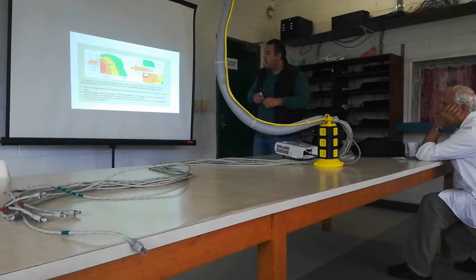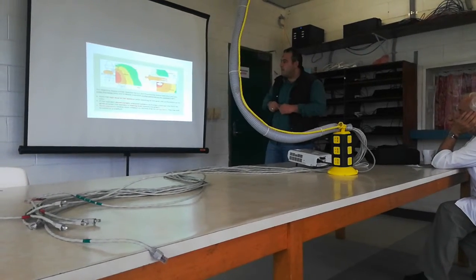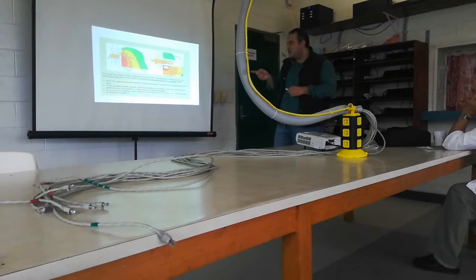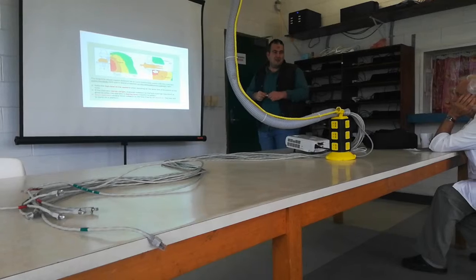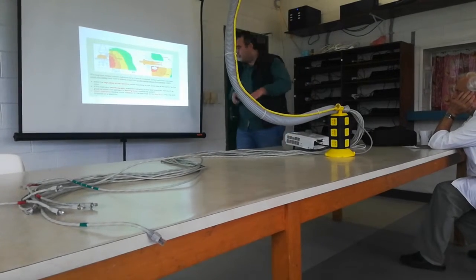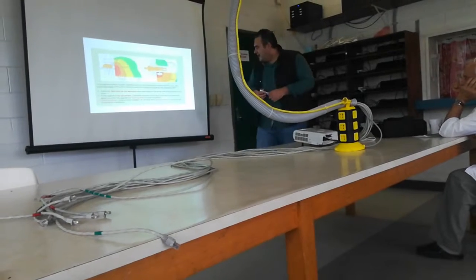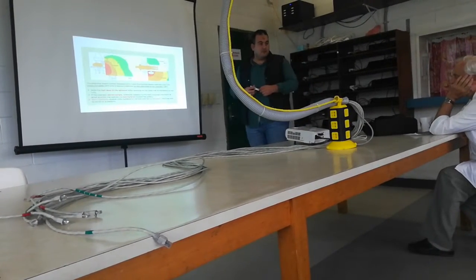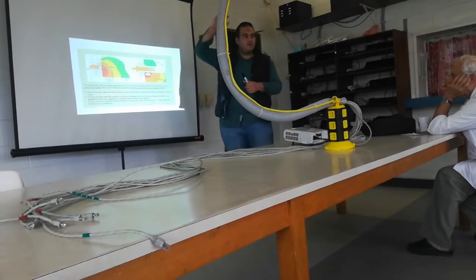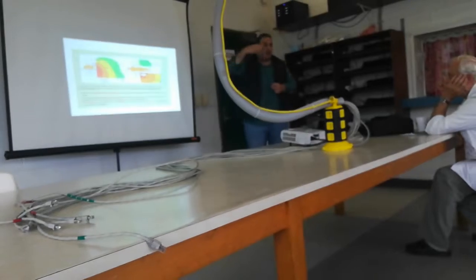Short operators receive more radiation to the face than tall operators. So if you are tall, you are lucky. They may wish to stand on a platform. If you are tall, your face will be exposed to less scattered radiation than if you are short.